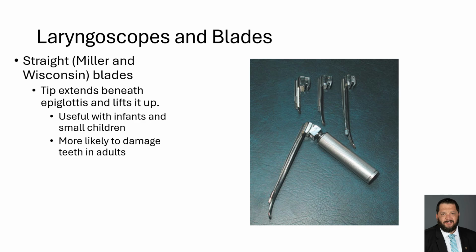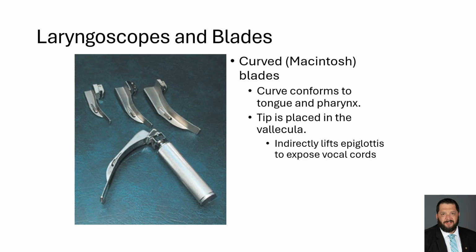And for this blade, the tip extends beneath the epiglottis and lifts up. This blade is particularly useful with infants and small children, but it's more likely to damage teeth in adults, and you'll have an opportunity to practice with each of these in the lab.